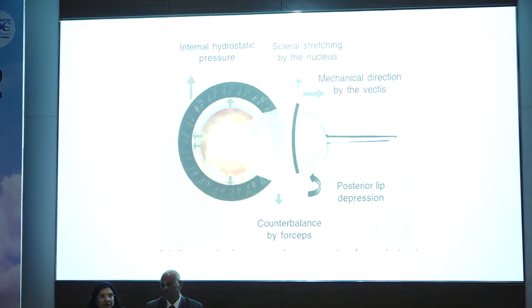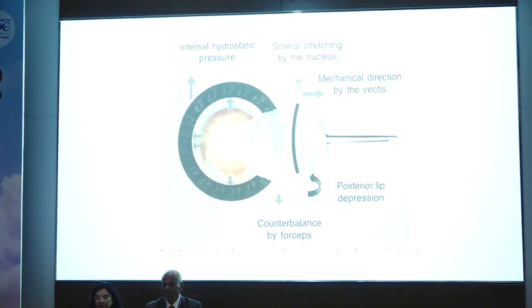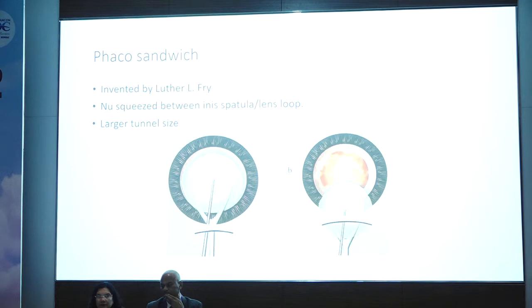The nucleus is stretching on the walls of the tunnel, and here of course we are giving pressure on the posterior lip, and by giving pressure on the lip, we are opening the mouth. So the more controlled this is done, the safer this is for the patient and for us in the long run. These are now only of historical significance.